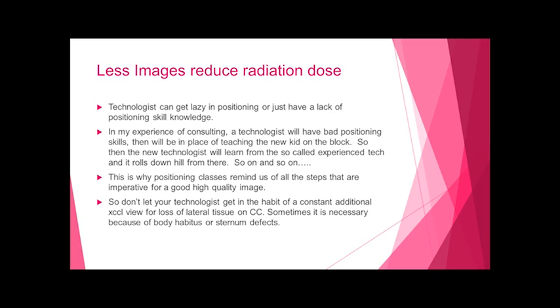Because you taught her maybe to start out on the lateral side of the breast. Well, we know we don't do that anymore. We start on the medial side of the breast. Just little things like that can make a huge difference in positioning. This is why positioning classes remind us of all the steps that are imperative for a good high quality image. Positioning has evolved. The new equipment has changed. The digital equipment has changed from film screen. So we have learned new tricks, and you want to be able to keep up with the new skills out there.